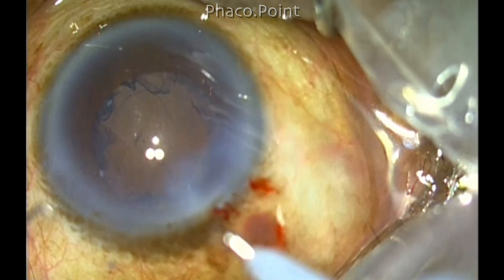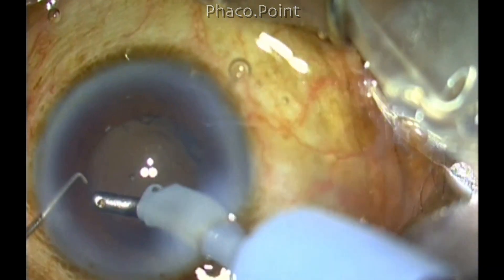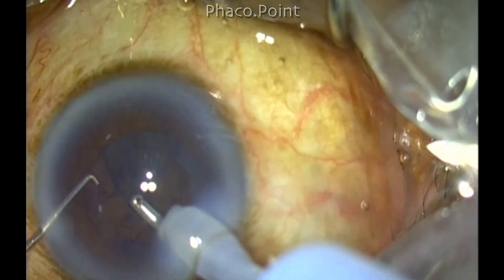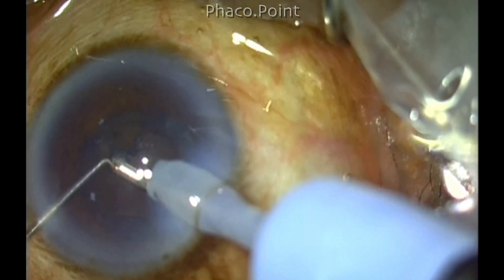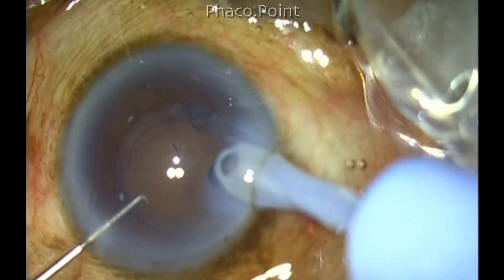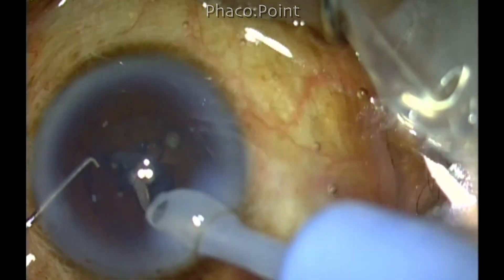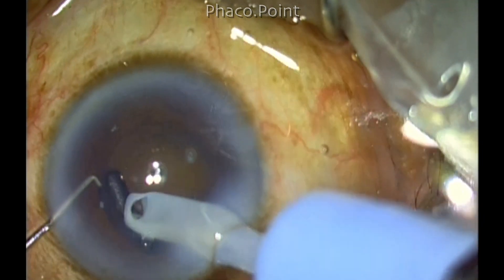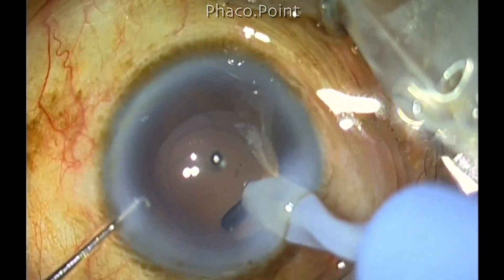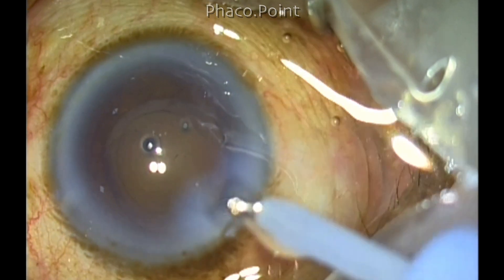I turn on the retro glow and begin cortical aspiration using my coaxial IA probe. The cortical aspiration is quite easy because you have done a good cortical cleavage hydrodissection. However, through the smaller size capsular rhexis, it is probably better to use a bimanual IA because you can access the different parts of the eye more easily by interchanging your hands. But since I am so used to the coaxial IA, I expose the tip a little longer, and also because I have an angled coaxial probe, I am able to access even the sub-incisional area quite easily.